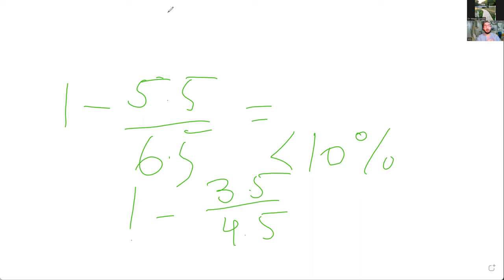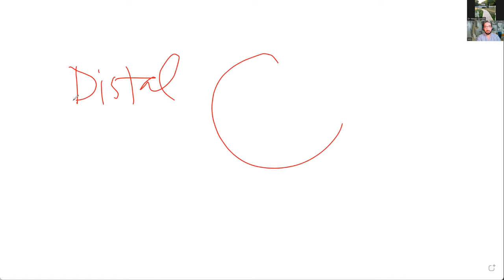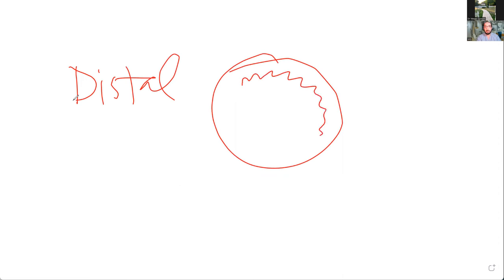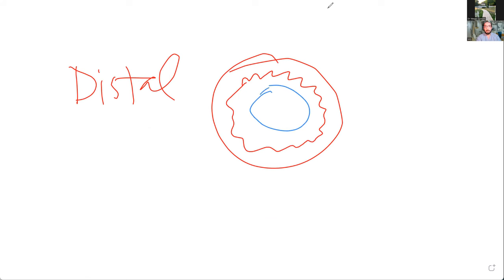That formula can be confusing. How can you quickly use it when sizing a stent with IVUS or OCT? What I do for a quick IVUS or OCT run is: I look at the distal vessel, identify the EEL and the lumen, and choose the luminal diameter — which should be disease-free — as my stent size.